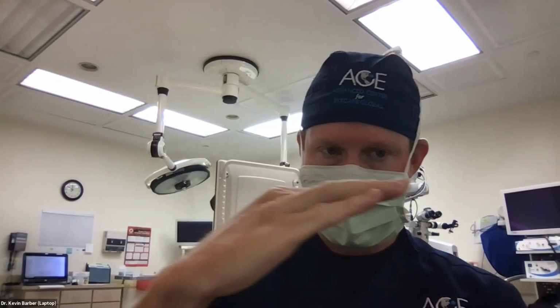I did forget to mention that it does help to angle the KDB up maybe 10 or 15 degrees to keep it in Schlemm's canal or in the trabecular meshwork. Sometimes just because of the curvature of the eye, it'll start to dive posteriorly. And if you get into the ciliary body or into the iris root, it's going to bleed. That's been probably the extent of the complication: a hyphema that you have to manage in a patient that already has glaucoma. So that's just something to be aware of.